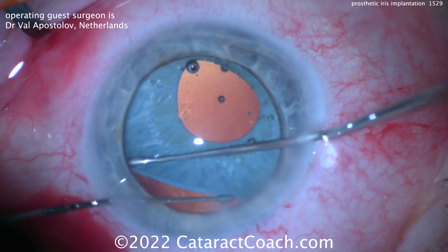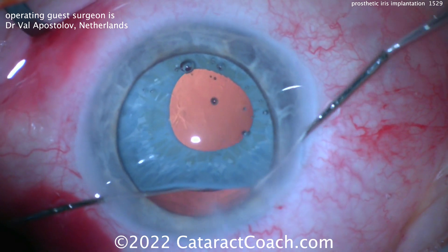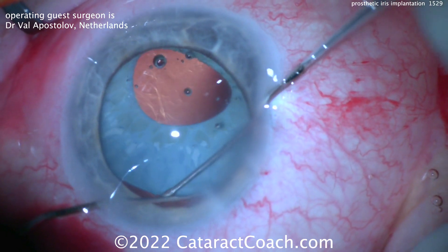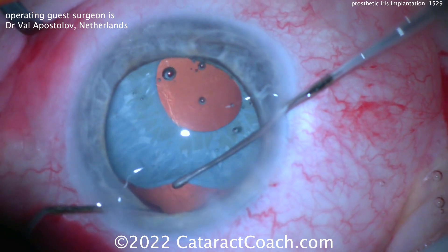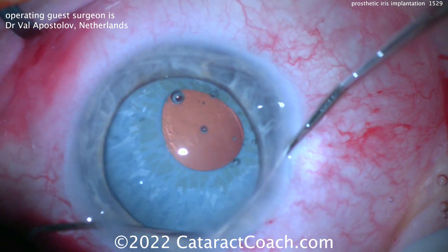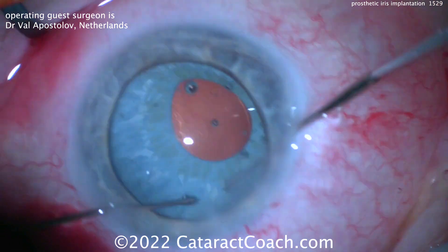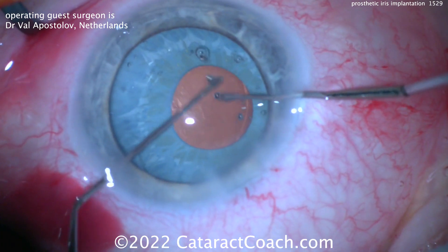If you don't have this device available — which may be hard to get in the USA — you can also do a purse-string type of suturing. You can use a purse string to suture around the iris pupil margin and create a pupil. Your goal is probably a 3.5 to 4-millimeter pupil. You can also do a four-throw pupilloplasty — just a few bites of that can help give you a pretty reasonable pupil. It won't be perfectly round, but it'll be pretty good and reasonable for conversation distance.